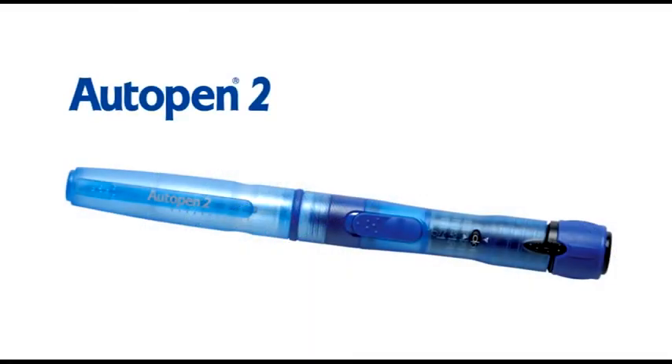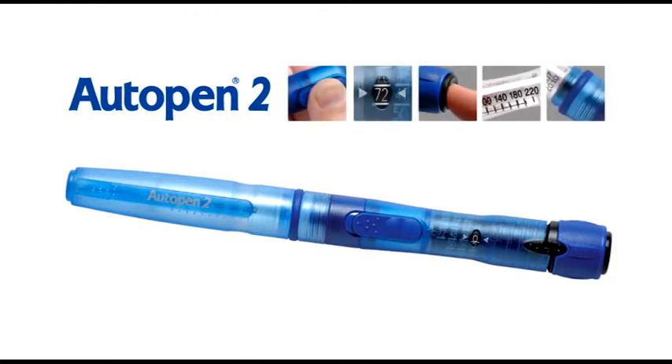Autopen 2 is the latest Autopen from Owen Mumford, with several additional features to benefit the user.